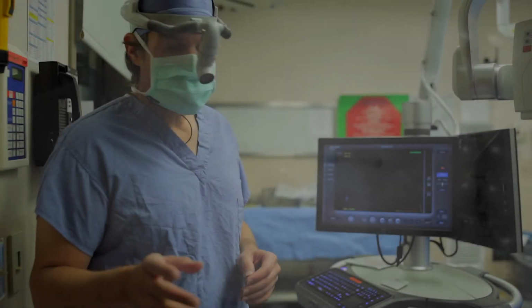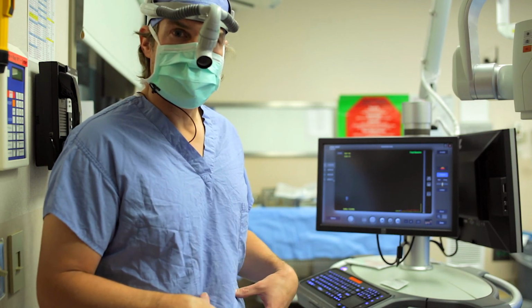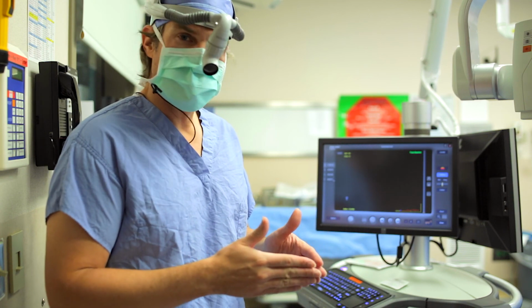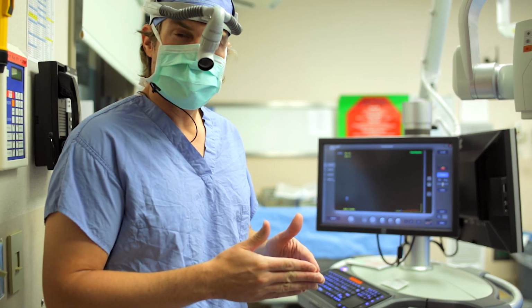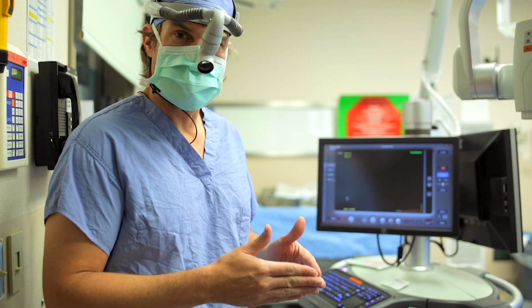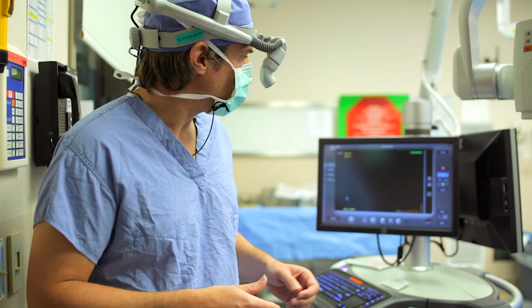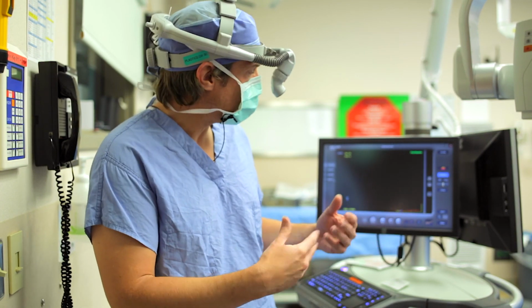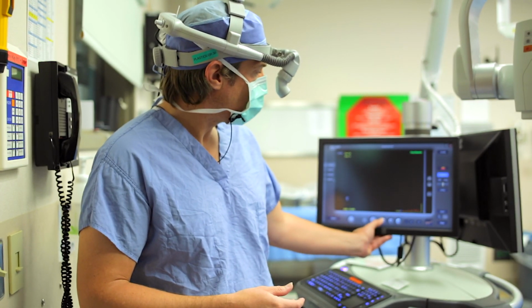And again, for completeness' sake, this is me now taking the black pen and just marking on the skin where that appendectomy scar was. So now we've taken that flap from the abdominal area and we've put it into the chest, and we've put together the deep inferior epigastric artery into the internal mammary artery and veins in this patient on each side. After that's all done, we've inset the flaps, and we're going to make sure that what we have is perfusing.